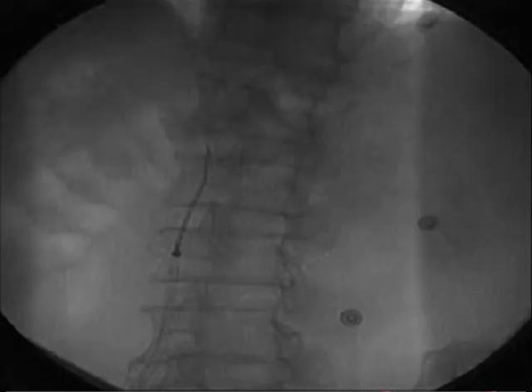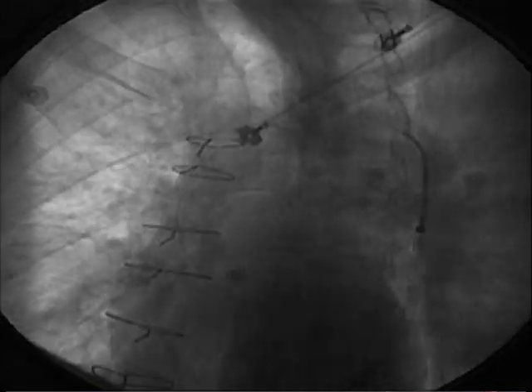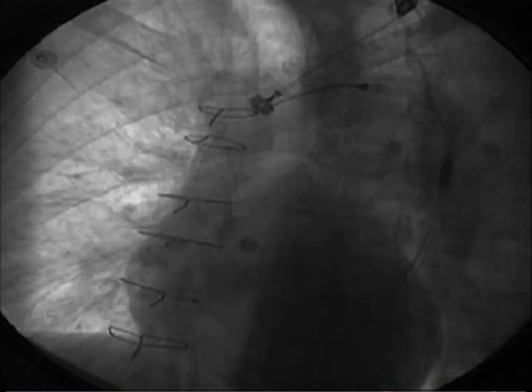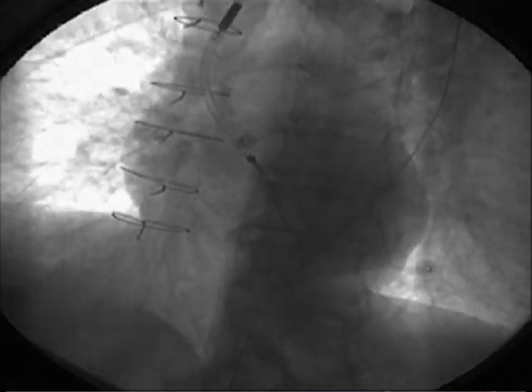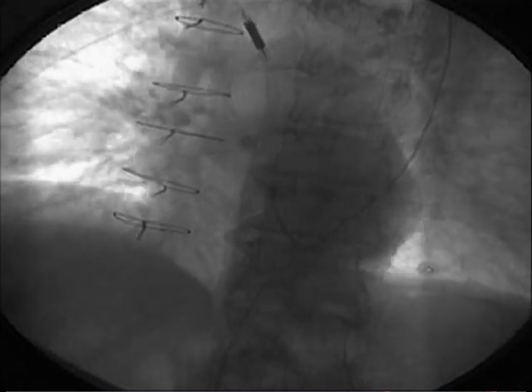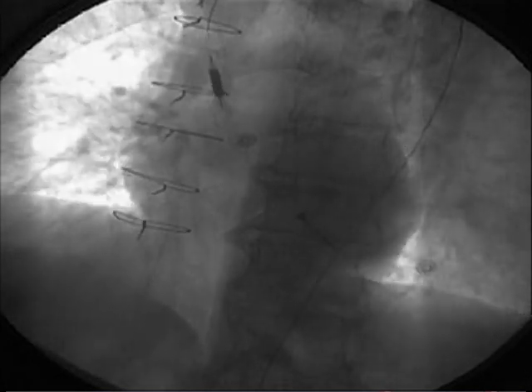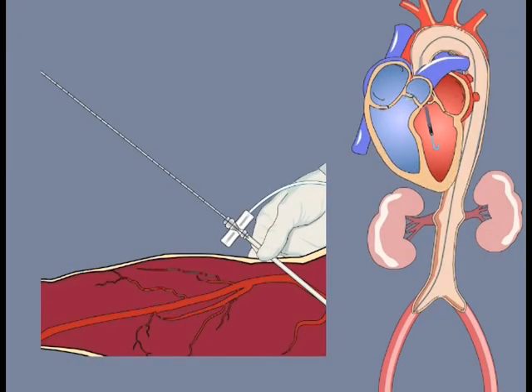You will then advance the catheter through the hemostasis valve into the femoral artery and along the placement guide wire and across the aortic valve using fixed exchange wire technique. Follow the catheter under fluoroscopy as it is advanced into the ventricle. Be careful not to coil the guide wire in the left ventricle. Verify that the pigtail and inlet are in the left ventricle and the outlet and motor portion are in the aorta.